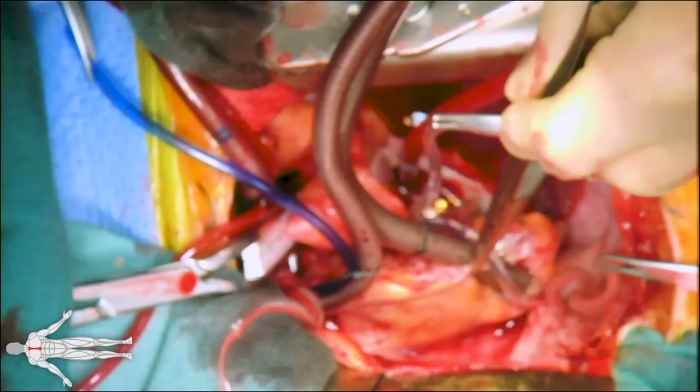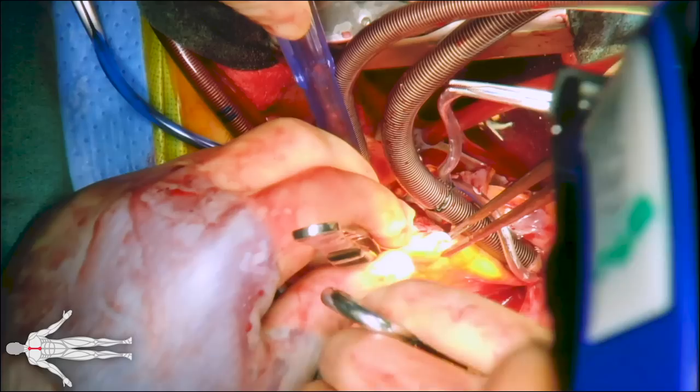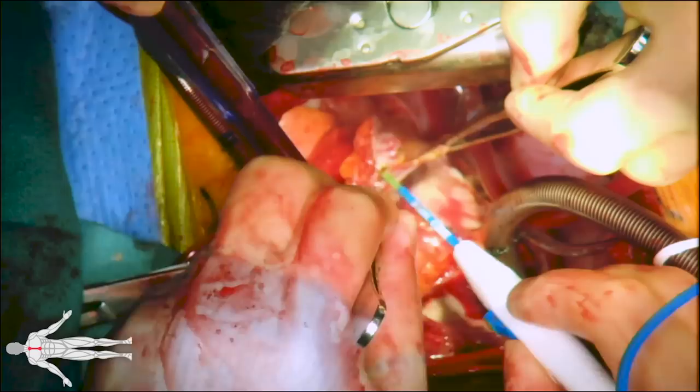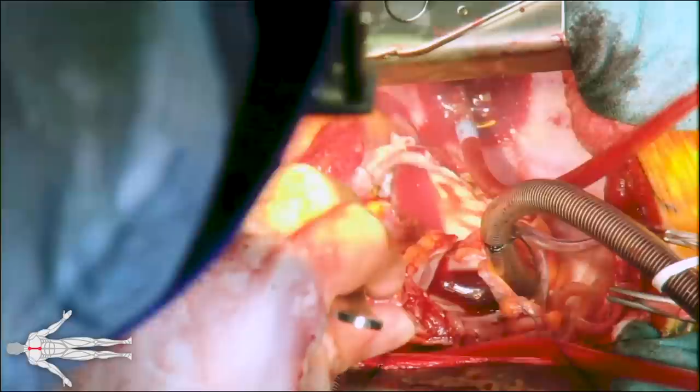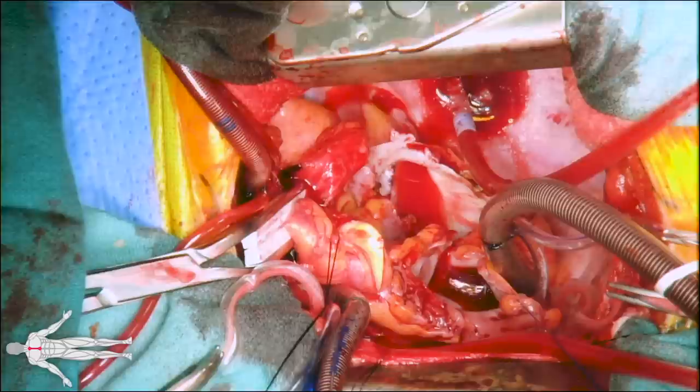A vent is placed to the patient's right superior pulmonary vein to prevent warming of the donor's heart during transplantation. The left atrial appendage is then excised and optimal hemostasis of the recipient's left atrial wall is achieved before bringing the donor's heart into the operative field.